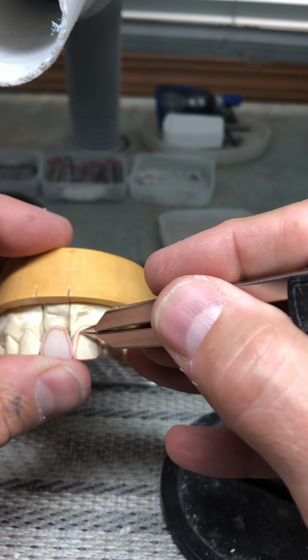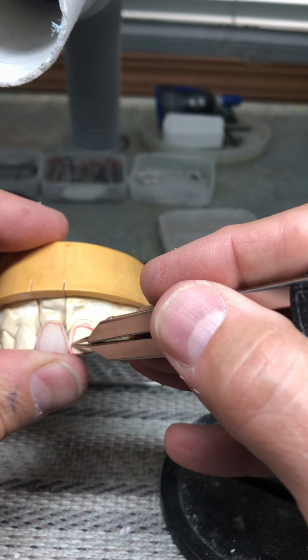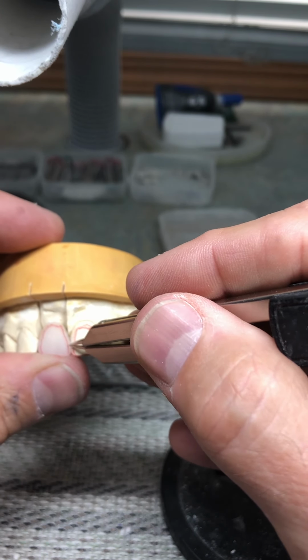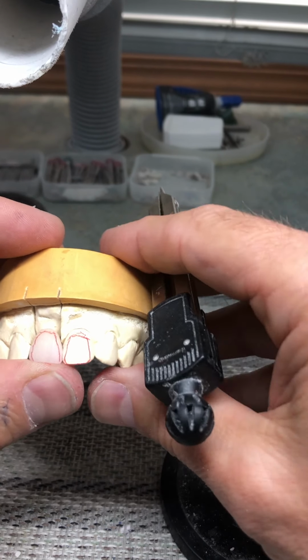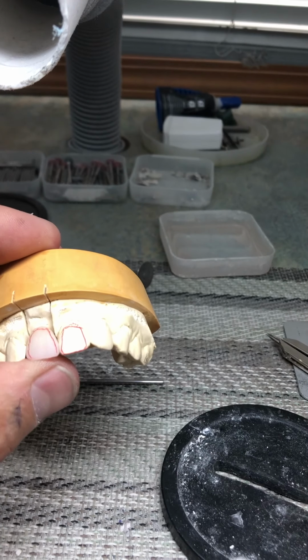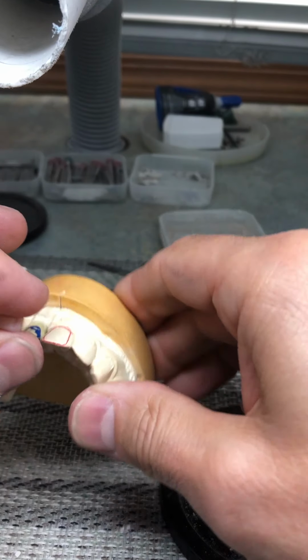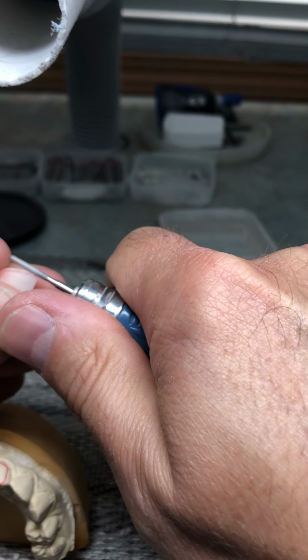the labial surface, but towards the distal aspect of that. It contours, leans towards the mesial, and then rolls back. Obviously there's a little wear on this mesial corner, but for a single central, we want to replicate that. This is a natural tooth, and it's not an old restoration that's bad. So I'm going to recontour this to sort of taper, just tilt towards the distal slightly. I'm going to use my diamond for this adjustment.